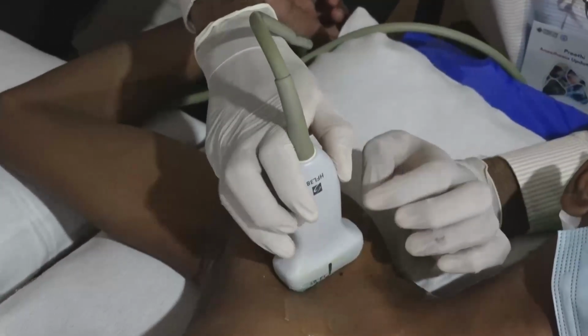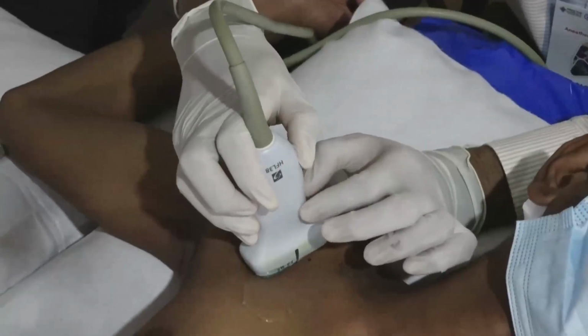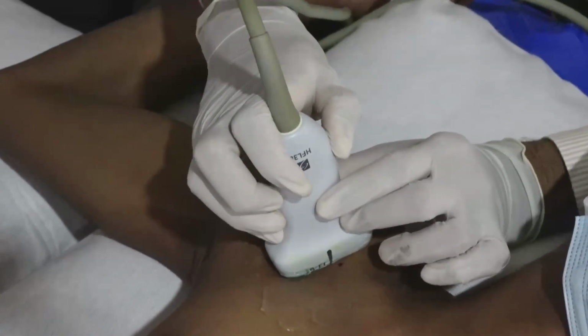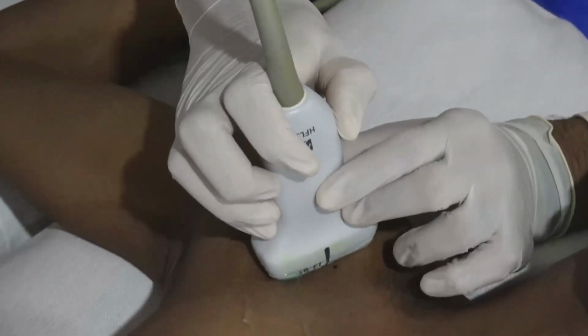You have to rotate the probe and keep the probe vertically, not in a transverse manner, for infraclavicular brachial plexus identification.